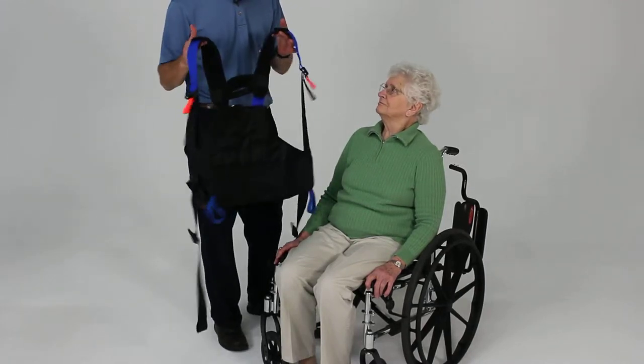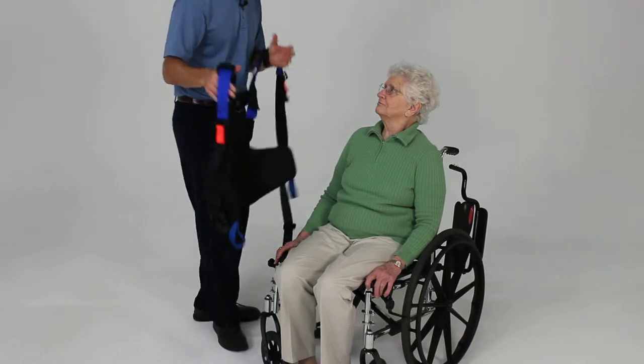We're going to cover the seated application of the balance harness. We're just going to go ahead and place this on like a vest here.